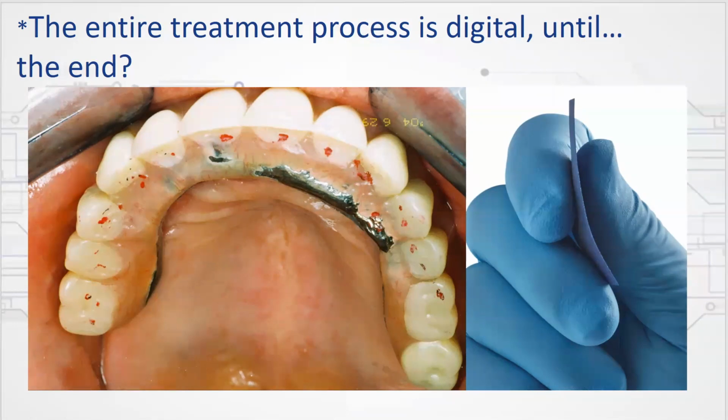In simple terms, an example would be we put in a crown and the patient says it's high, and we go and mark it and we grind the contact we think it is, and the patient says, no, Dr. Kerstein, it's still high. So what did I do? I chose the wrong contact. I didn't improve it, right? If you've had that experience, you've been choosing the wrong contacts. Now magnify that out to 14 units of a hybrid restoration or 28 units of crown and bridge, and that process becomes extremely difficult to control.